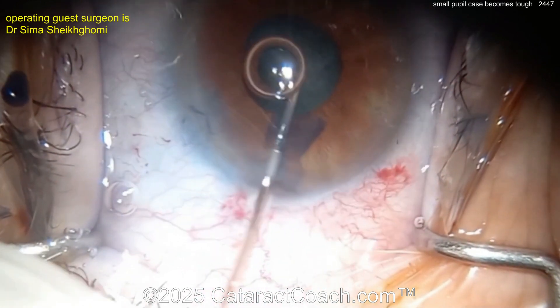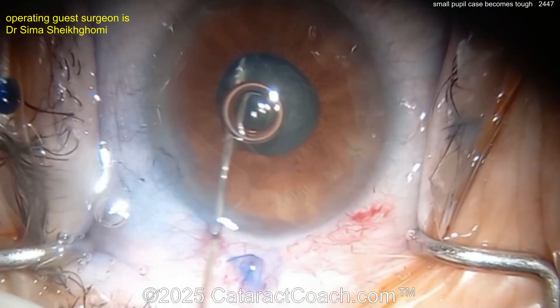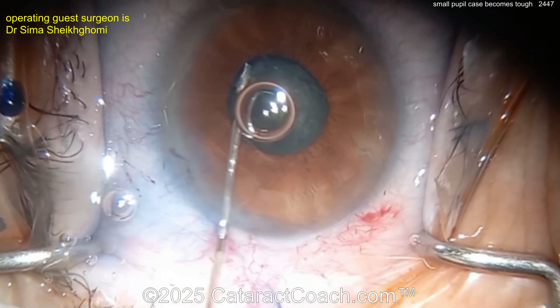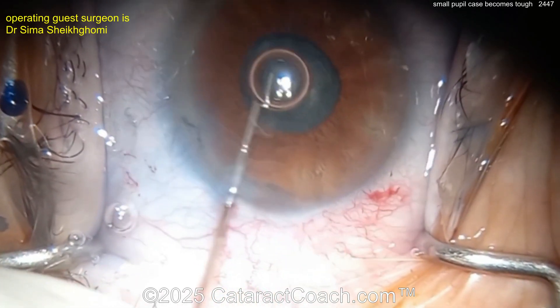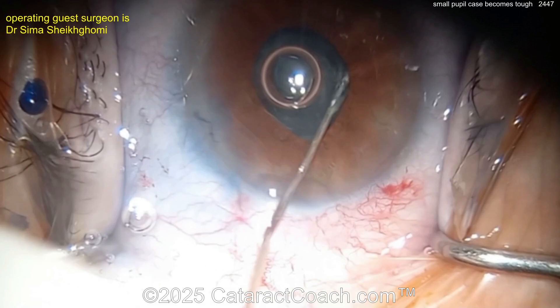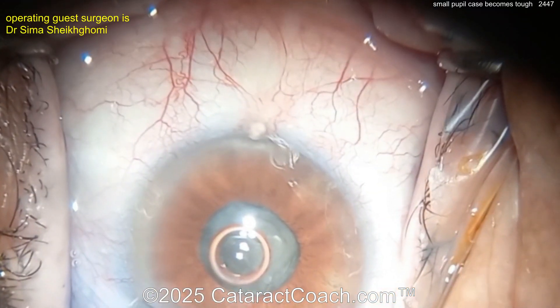Now going inside with BSS, trying to do some hydrodissection — hard to see. Look, the pupil came down. If this is not your forte, you may want to consider putting in iris hooks or a pupil expansion ring. Look at that pupil — it's now down to three millimeters.